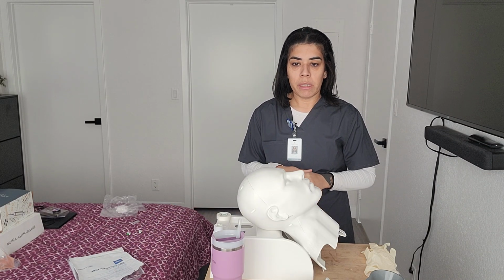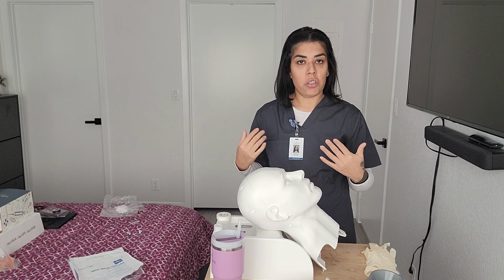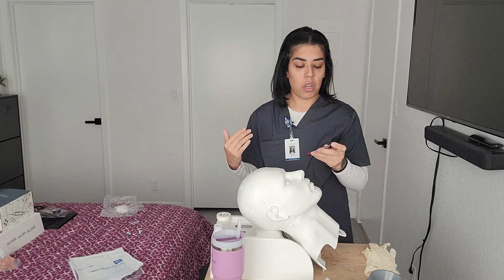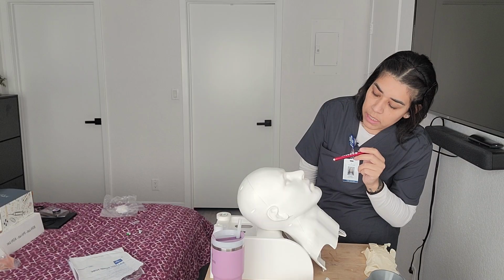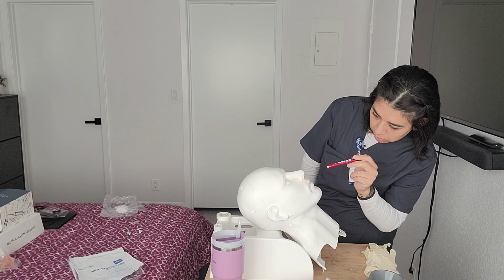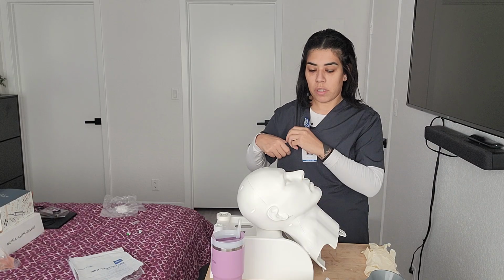So first what I'm gonna do is I'm gonna go ahead and check the patient's nostrils, make sure there isn't any obstructions in each nostril. With our pen light, we have the patient hyperextend the neck. All right, Mr. Manny, we're gonna go ahead and check inside each nostril. All right, make sure everything looks good. There's no obstructions. Perfect. There's no obstructions there.